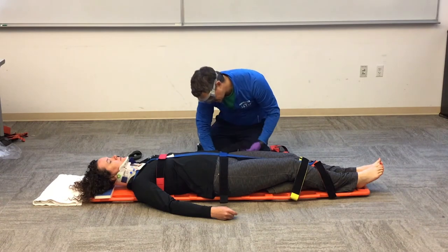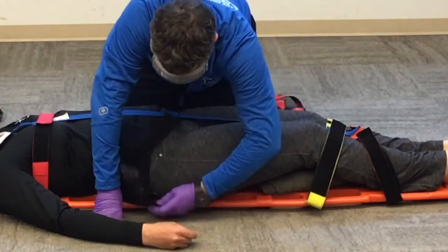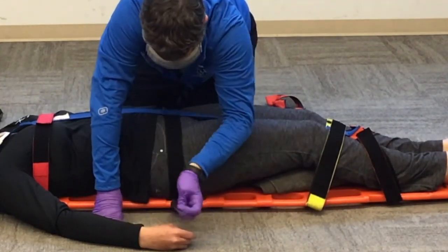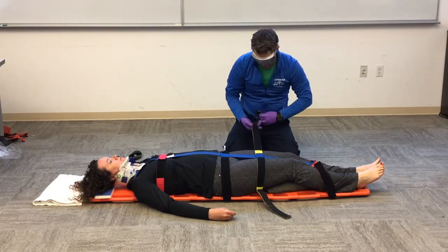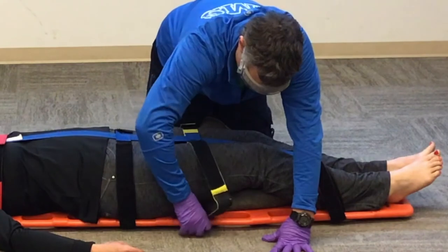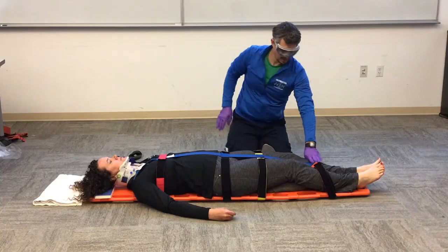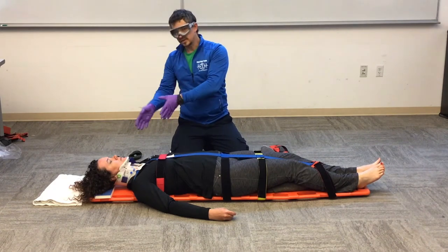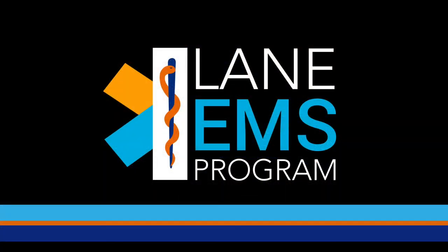Now I'm going to secure the patient's hips, and then above her knees on her thighs. I've already got the lower leg secure. And that's my spider strap. Now I'll go ahead and secure the head, make sure I do my CMS, and I'm done. I'll go ahead and secure the front arm.